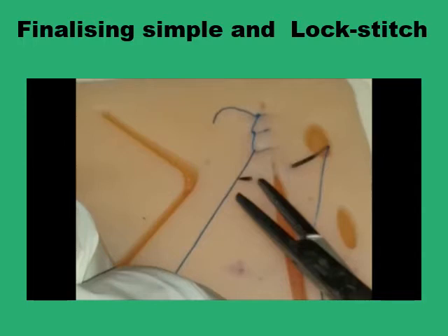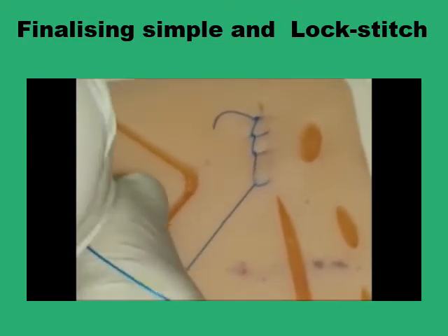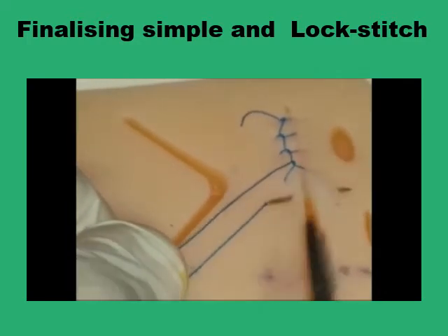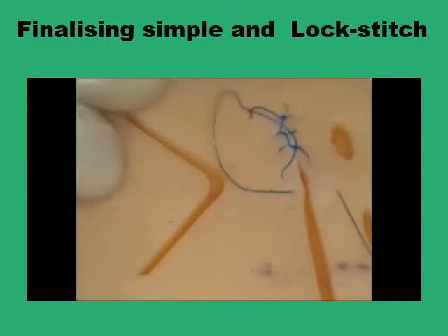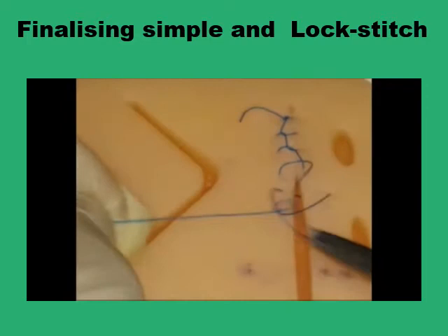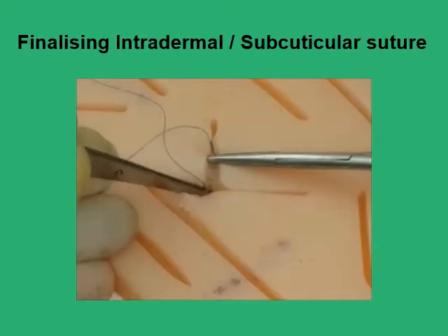The other issue to consider when finalizing your suture line is changing the direction of your needle to form the last stitch. You do this with the simple continuous suture pattern or the blanket suture pattern: you finish up your suture line, reverse the needle and go to the other side — now from the opposite to the initial side — leave a loop of the suture, retrieve the needle with the last bit of the thread, and now you can use either the Aberdeen knot or the more traditional way of forming a knot between a loop and a single strand.